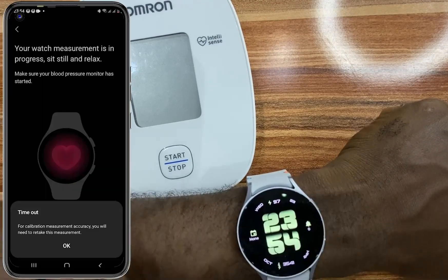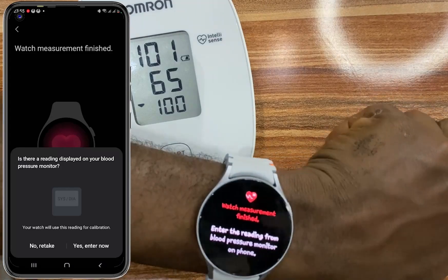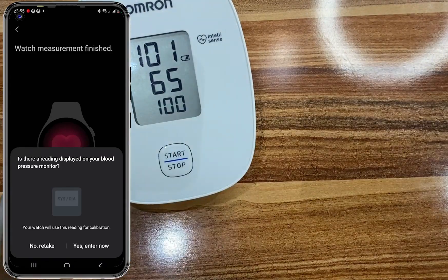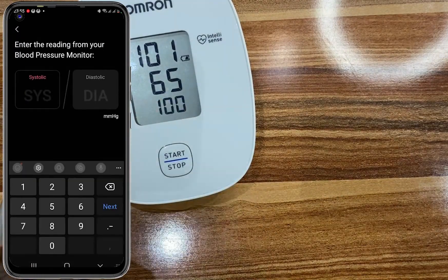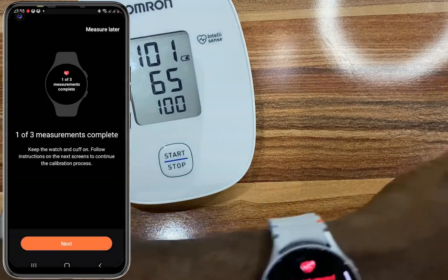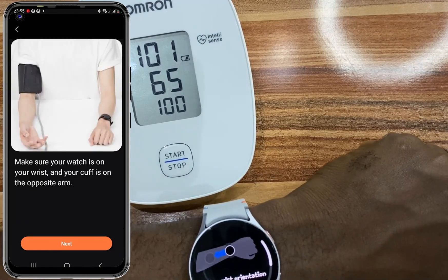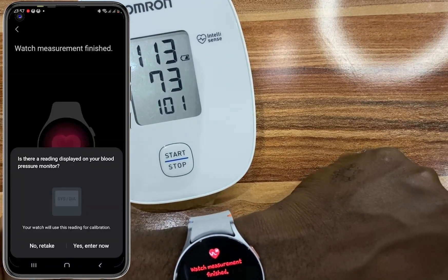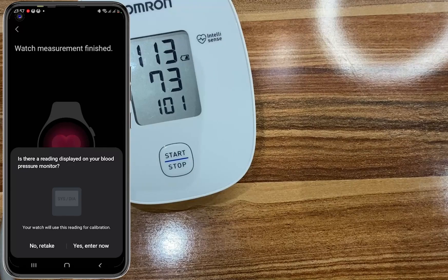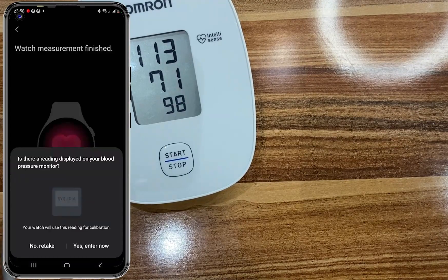Once you have done that, go back to the SHM app on your phone. We have the first reading. Go ahead and tap on Yes, Enter Now, and enter the readings you have on your blood pressure monitor. Tap on Done and confirm. We need to take this measurement three times, so tap on Next for the second one. We have the second measurement — tap on Yes, Enter Now, and enter what you have. Then we take the last measurement.